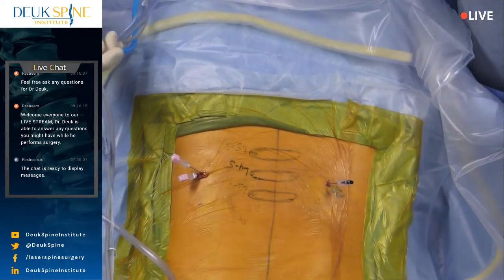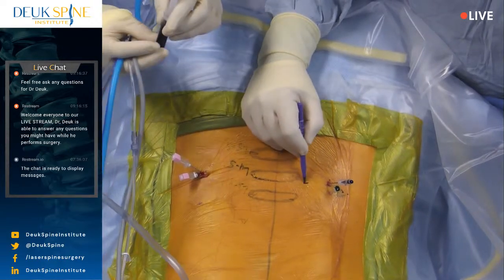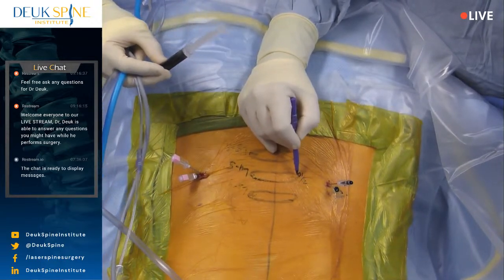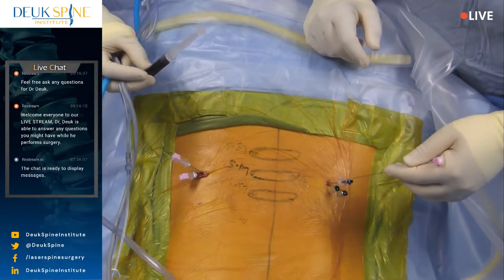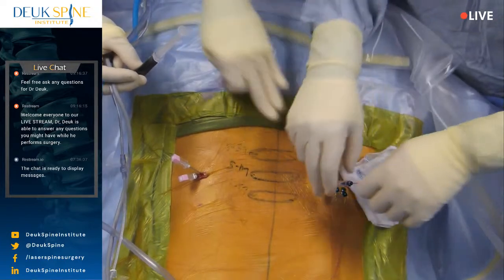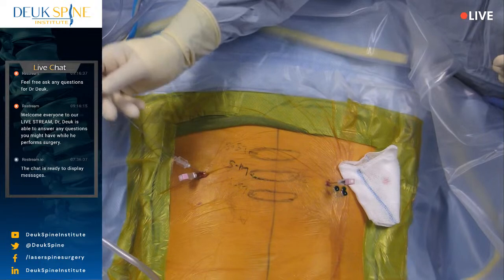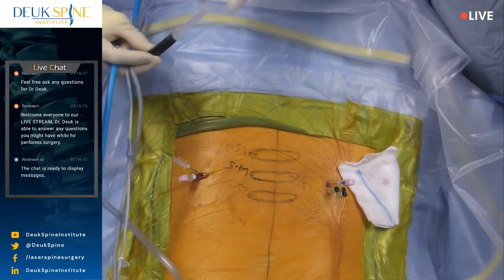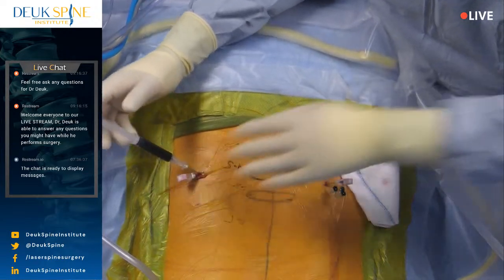So that is L4-5, but I think because mostly I was a little more anterior in the disc, that's why we didn't get the posterior experience, which works out in his favor. Sorry, her favor. All right. We're almost done. Now this one was painful to get into, so I believe this is going to be a more painful disc.